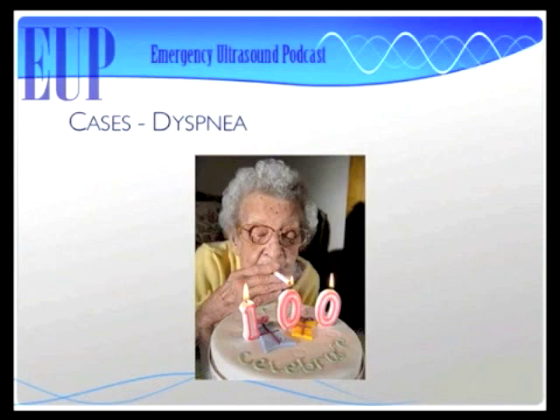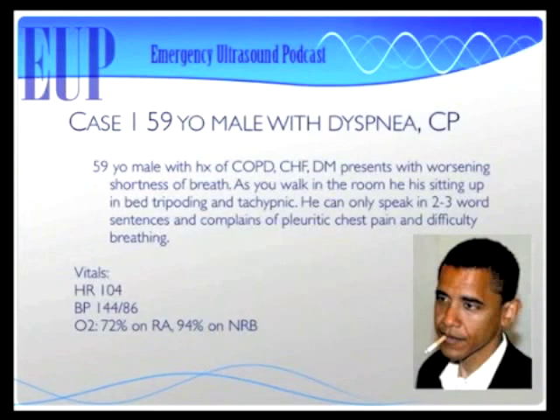All right. So case 1. Here we go. We're going to do some cases to try to solidify all this stuff that I've been barking at you about. So that guy looks really familiar. Yeah, I've seen him somewhere too.